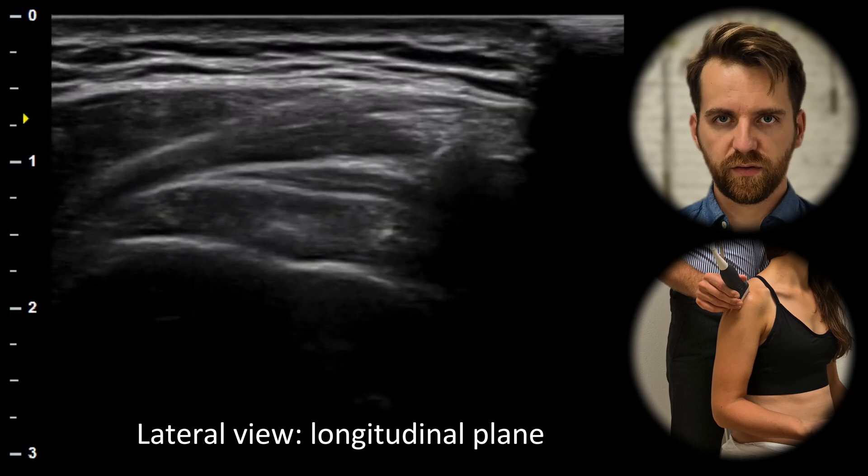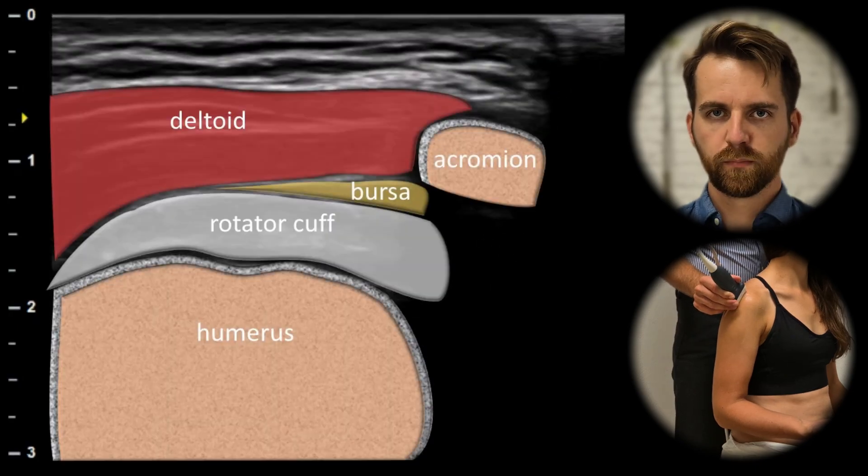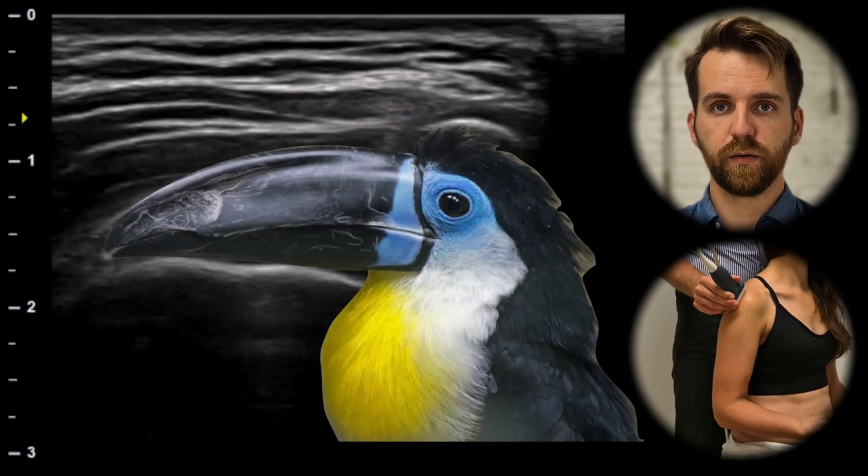When we rotate the probe by 90 degrees, we can see the rotator cuff in the long axis. In this view, a healthy rotator cuff should look like a bird's beak.